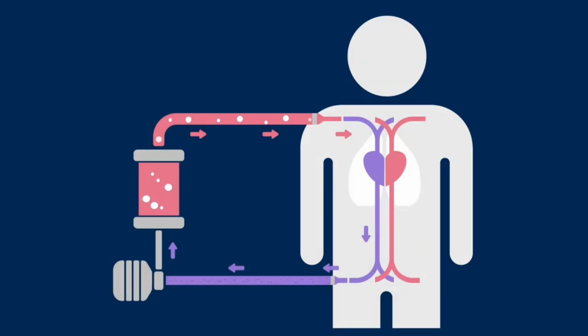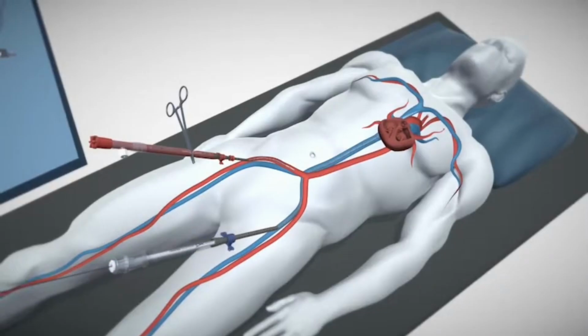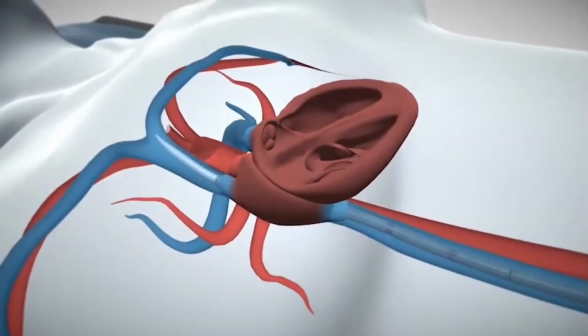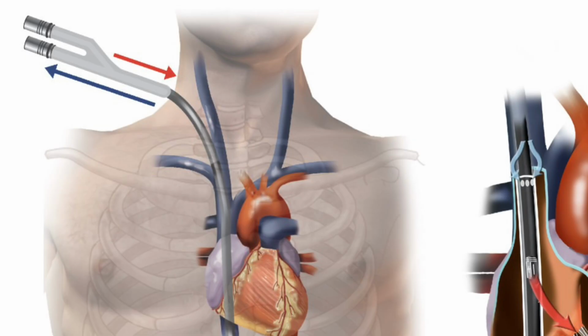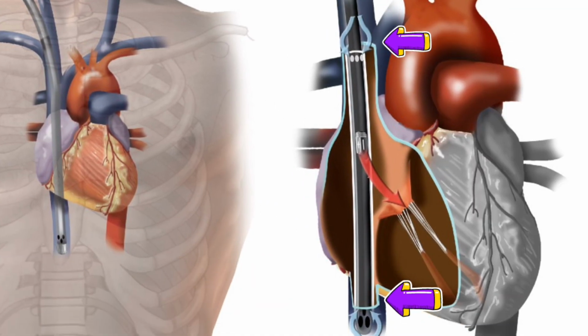Venous cannulas are usually placed in the femoral vein for drainage and the internal jugular vein for reinfusion. The tip of the drainage cannula should be maintained near the junction of the inferior vena cava and right atrium. Alternatively, a double lumen cannula is available. It is inserted into the right internal jugular vein, draining blood from the SVC and IVC and returning it to the right atrium.